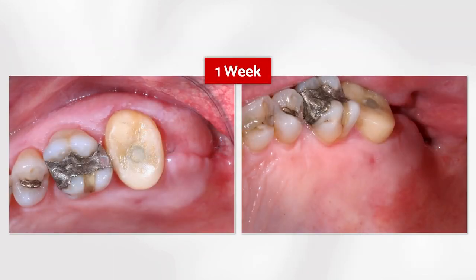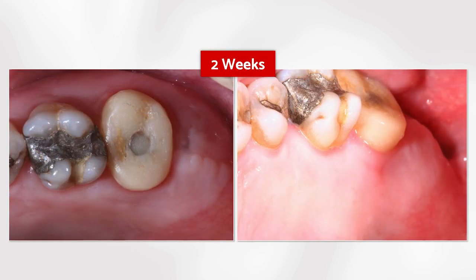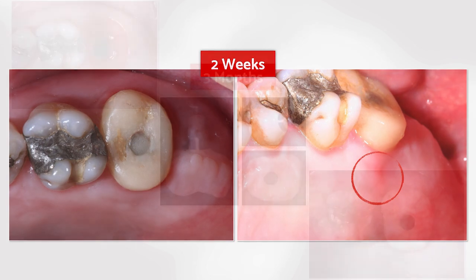At 1 week post-op, I want to call your attention to the healing of soft tissue where the abscess started. At 2 weeks post-op, we cannot see the presence of the abscess anymore, and we have very good healing of soft tissue all around this provisional restoration.